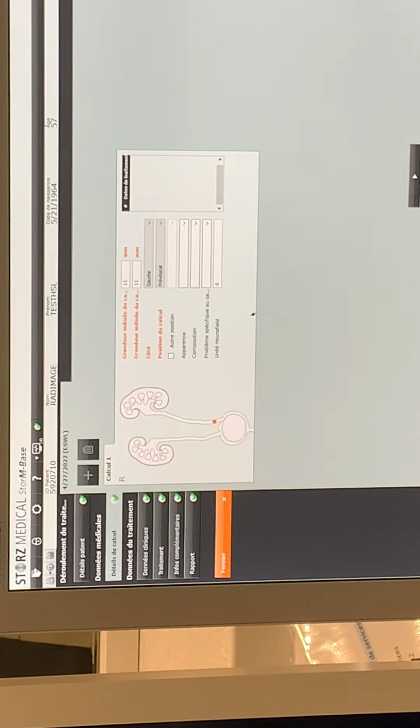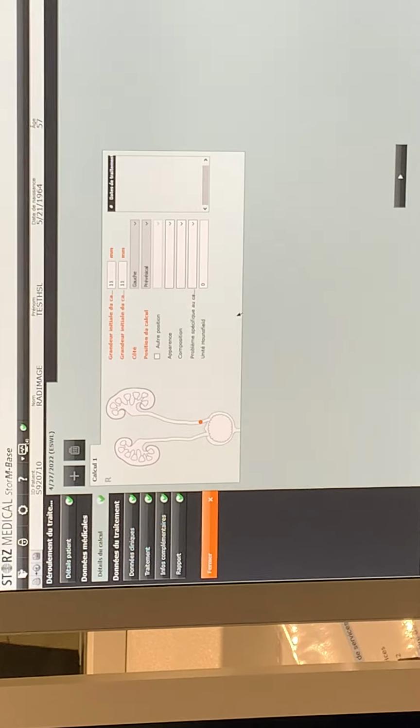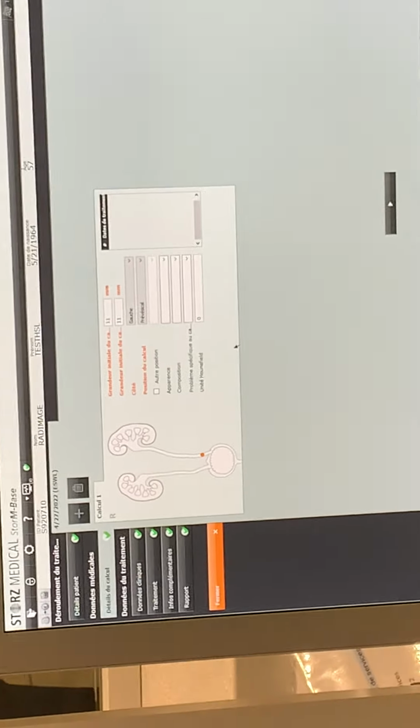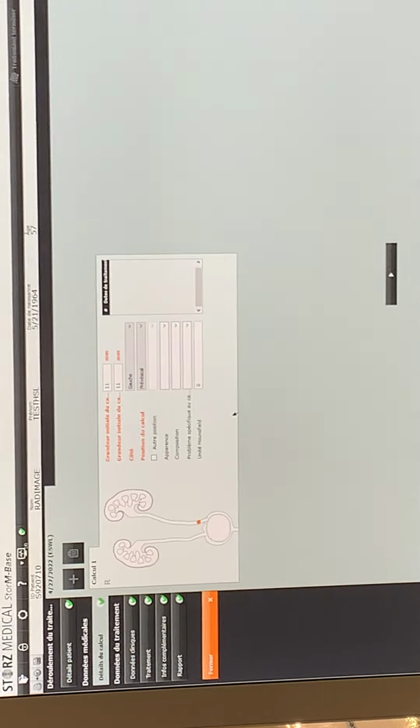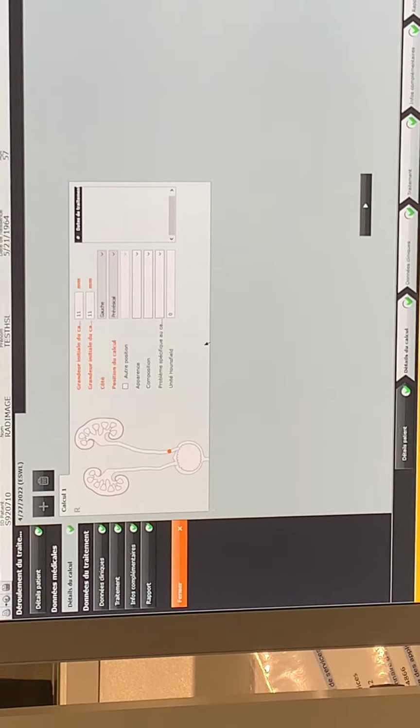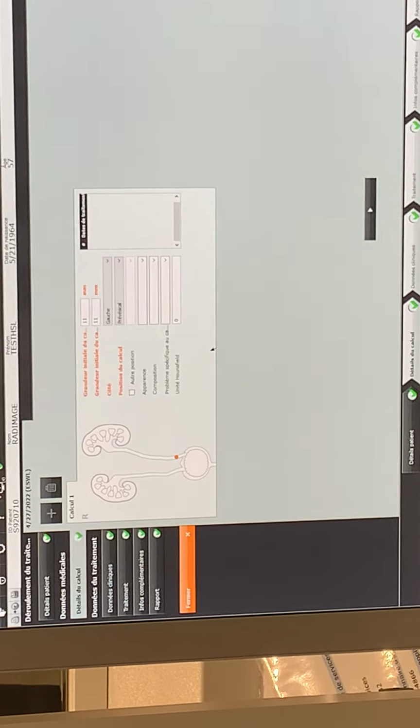You can put it to your patient documentary or whatever you would like to do with that. Maybe in the future there's coming some other things, but we will see. At the moment we have that paper document. And how do you go back to the next patient?